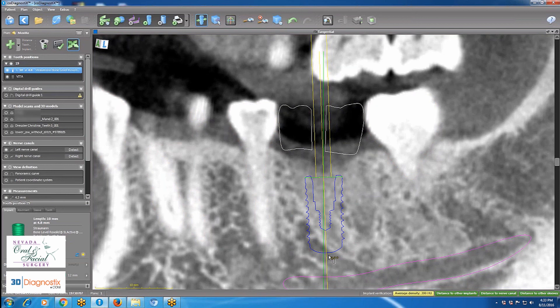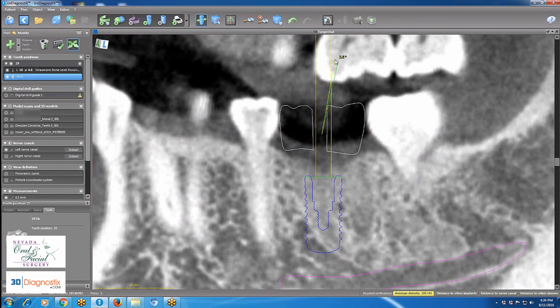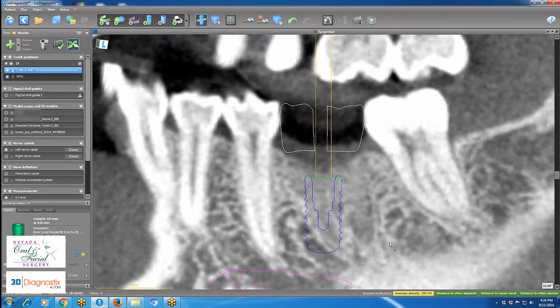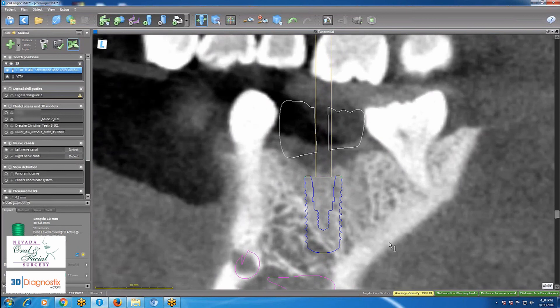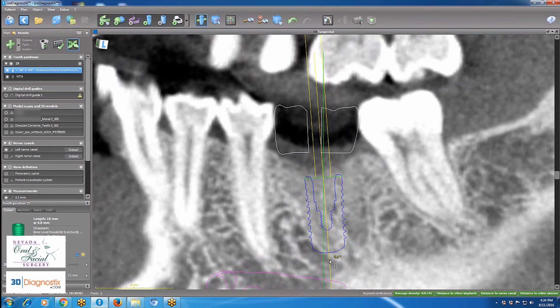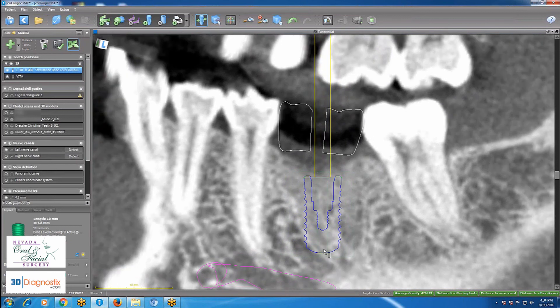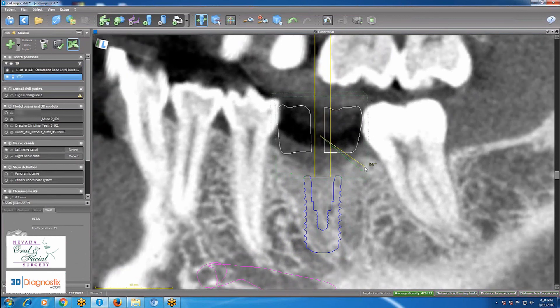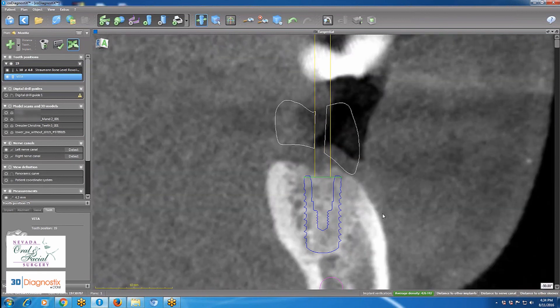Then I go to the tangential view, where I can view the implant from all different angles — 180 degrees all around. I still tweak my crown and implant to be in the most perfect position. The sockets are still visible, so I'm going to place the implant more or less in the previous sockets of the previous tooth.